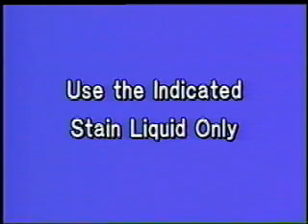And the liquid may dissolve plastic materials. Be cautious about applying it to plastic materials. Use the indicated stain liquid only. Avoid any cross-use with other makers' materials.